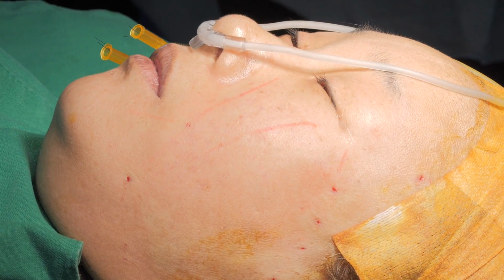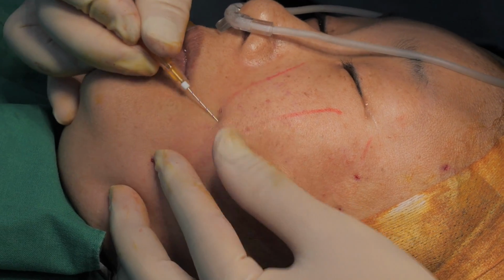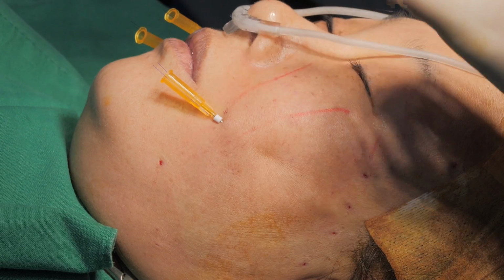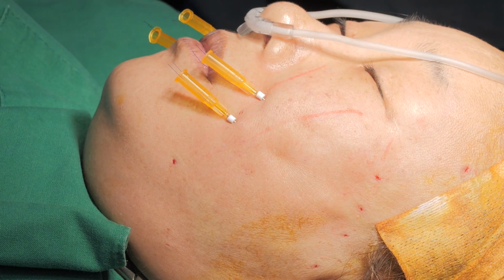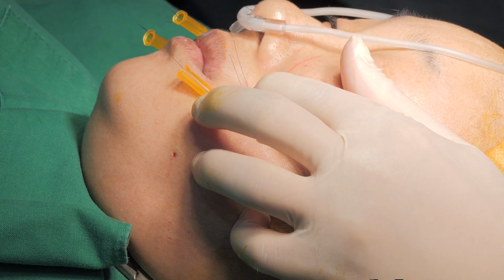I rarely use thin thread, but it's loaded on a needle. That's why it causes bleeding. When you remove this, oh sorry.